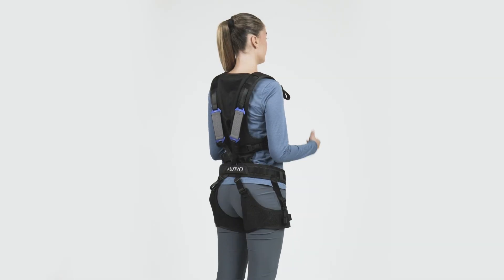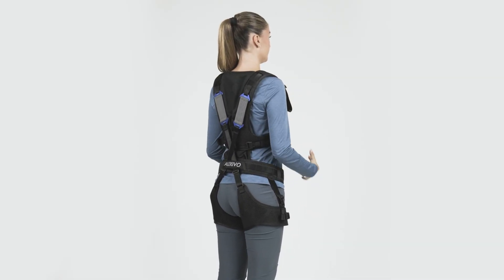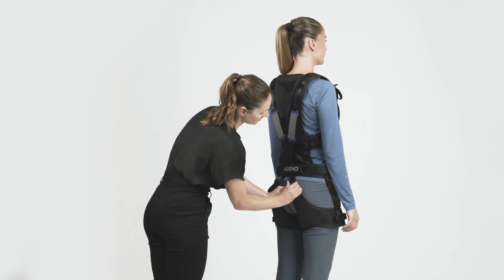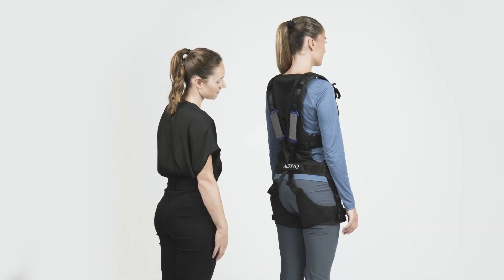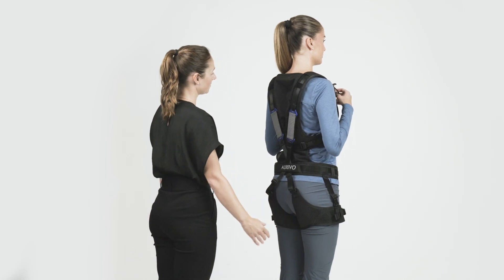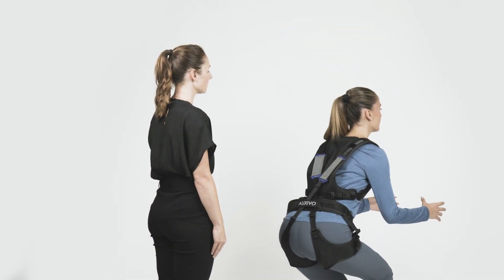The activation loops are used to pre-tension the elastic bands on your back. During first-time use, the back length of the LiftSuit needs to be adjusted to your body height. The straps should be long enough to allow you to sit down comfortably when the support is deactivated. However, the straps should be short enough to allow the elastic bands to stretch and support you when the Exoskeleton is activated.